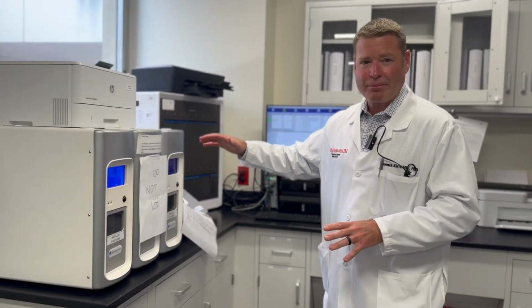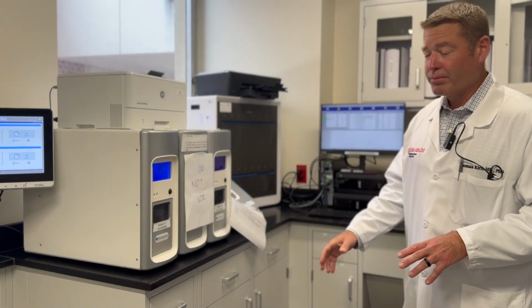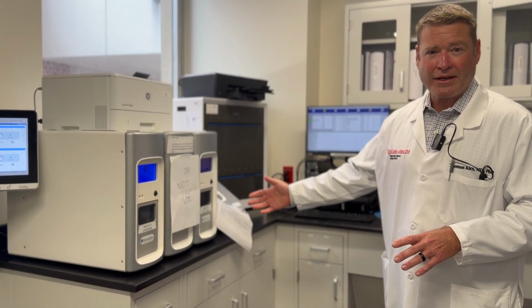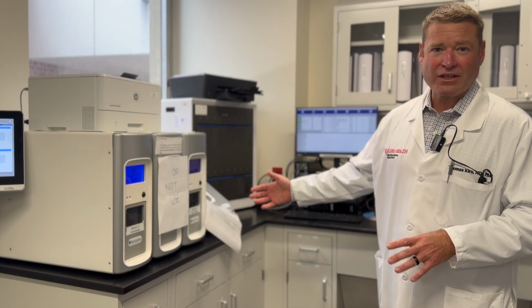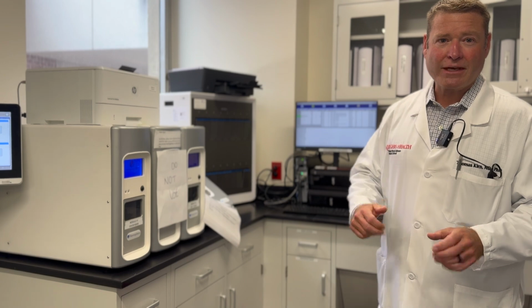One example of that type of instrument is here, this is called a Verigene instrument. Blood culture broth from a patient that has a signal-positive blood culture is placed into the instrument, and the instrument will rapidly identify gram-positive bacteria that are growing in that culture and also give you some molecular information about susceptibility predictions that can be used rapidly to refine antimicrobial therapy for those types of patients.